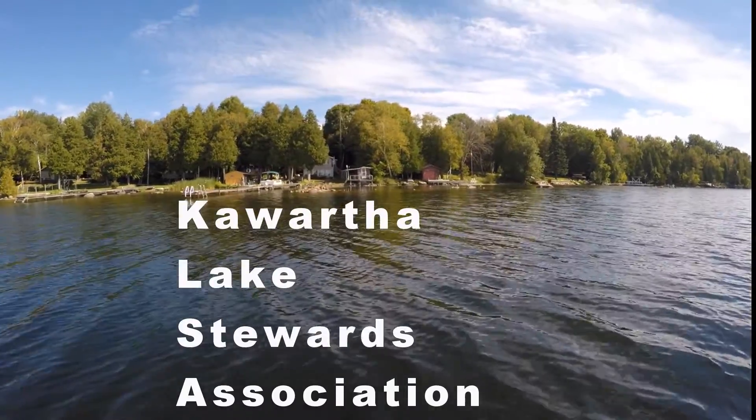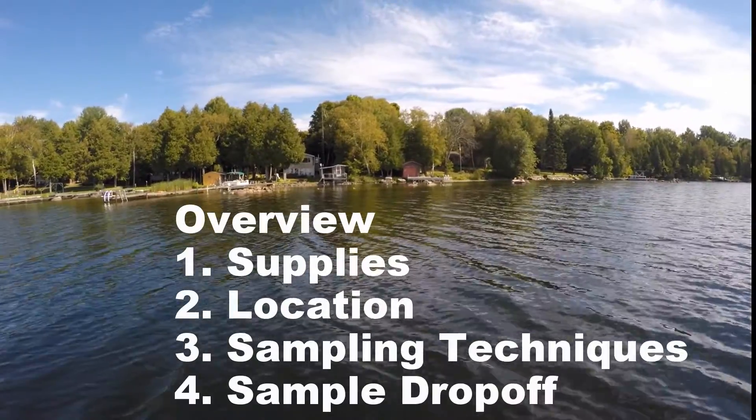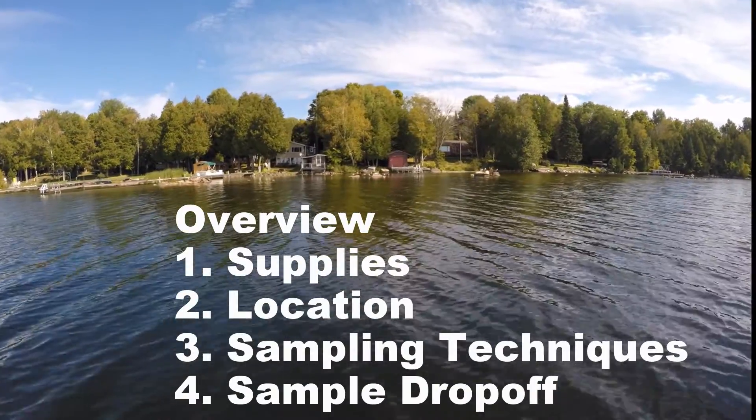Welcome to the Kawartha Lake Stewards Association video on E. coli sampling techniques. In this video we will go over the supplies needed, how to choose a location, the proper sampling techniques, and where to take the sample once complete.